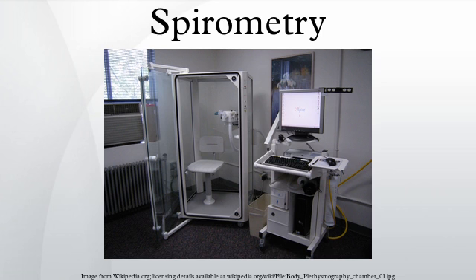Thus, this test is not suitable for patients who are unconscious, heavily sedated, or have limitations that would interfere with vigorous respiratory efforts. Other types of lung function tests are available for infants and unconscious persons. Another major limitation is the fact that many intermittent or mild asthmatics have normal spirometry between acute exacerbations, limiting spirometry's usefulness as a diagnostic. It is more useful as a monitoring tool.